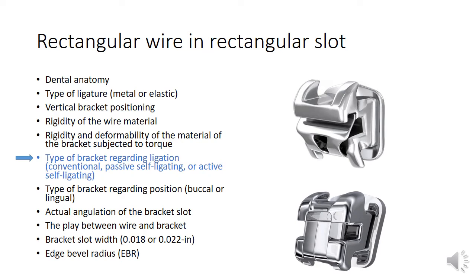So it can be concluded that active self-ligating brackets are more capable of controlling torque of the tooth.